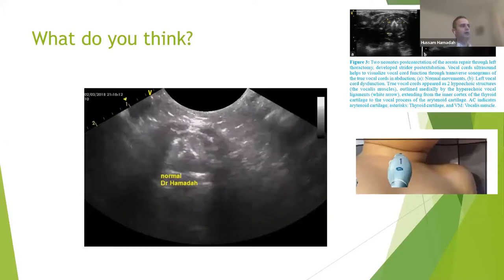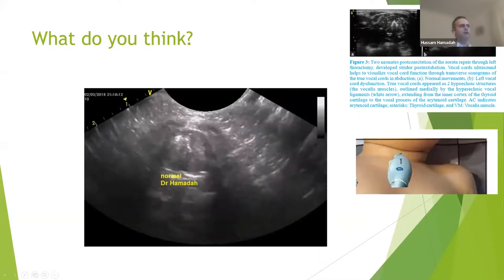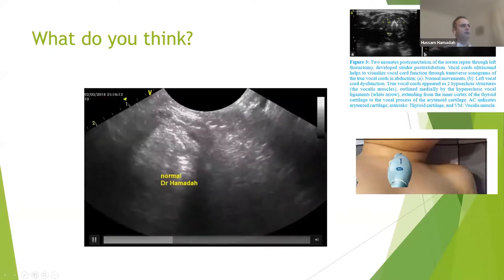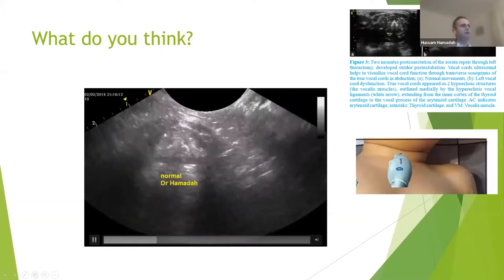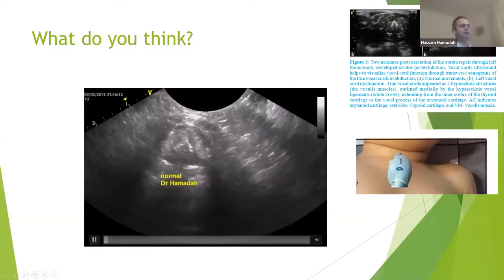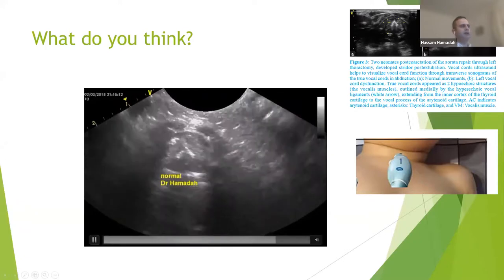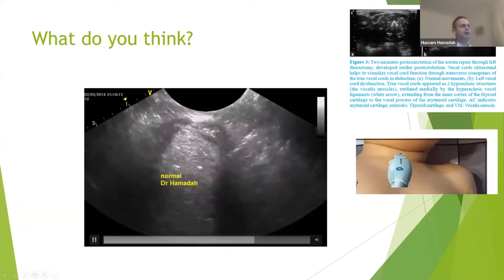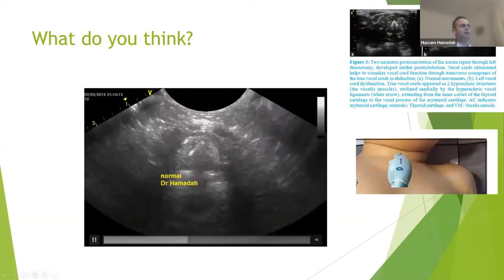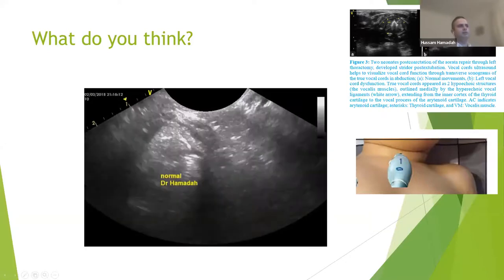So you are going to put your probe in the neck. The marker will be toward 9 o'clock. So this is the right of the patient, this is the left of the patient. And you look at these two thin, bright echogenic lines here. These are the vocal cords, and you will see the movement. In this view, it's very clear that both vocal cords are moving nicely. Around the vocal cords, here, you will see the vocal cord muscle. Then you will see the thyroid structures here. And here you will see the arytenoid cartilage, both white dots here. It's in this image also.